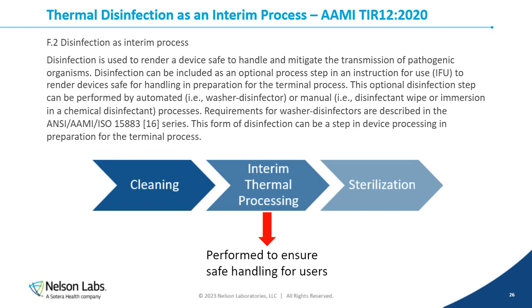So we see interim disinfection procedures being validated and being requested to ensure that the sterile processing technicians in the sterile processing department are safe when they handle the devices. They've been observed preparing the devices for sterilization not wearing gloves. So just to mitigate any transmission of pathogens, we see countries in the EU requesting interim disinfection procedures on those critical devices. And we typically see it more with thermal disinfections or thermal processes.